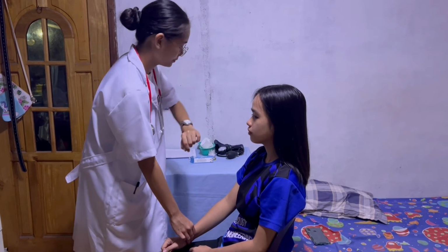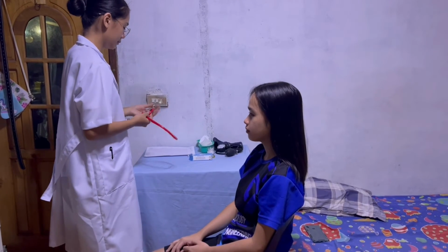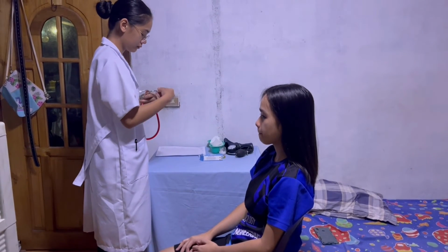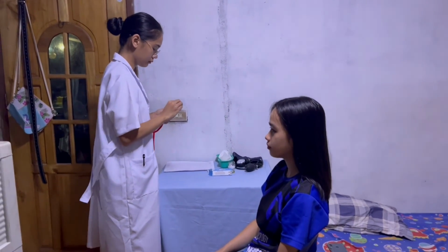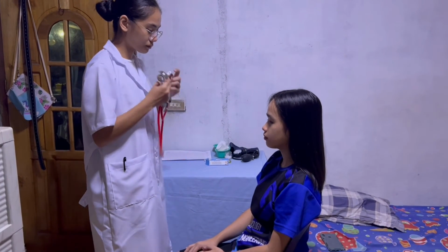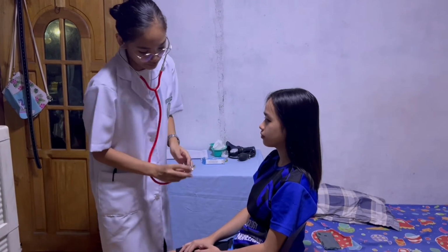Since the client is in the sitting position, we will assess the apical pulse. Locate the apical impulse. Auscultate and count heartbeats. Use antiseptic wipes to clean the earpieces and the diaphragm of the stethoscope. Insert the earpieces of the stethoscope into your ears in the direction of the ear canals or slightly forward.